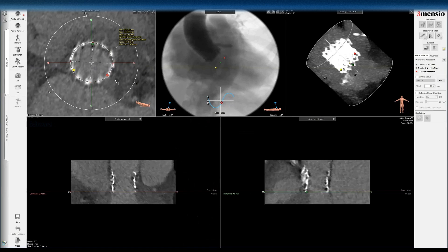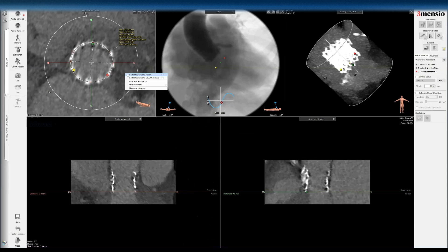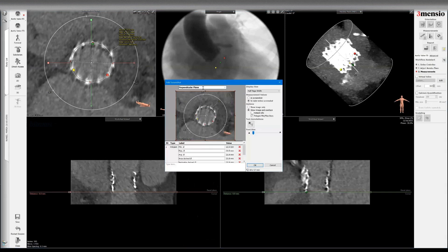If the failure mechanism is paravalvular leak, you might be able to expand the valve further to reduce it. But if it's transcatheter valve failure, we'd typically expand this more to nominal size to maximize internal diameter, so the second transcatheter valve will have optimal hemodynamics and expansion. I'll save this measurement as '23 S3 inflow' so we know what it is.